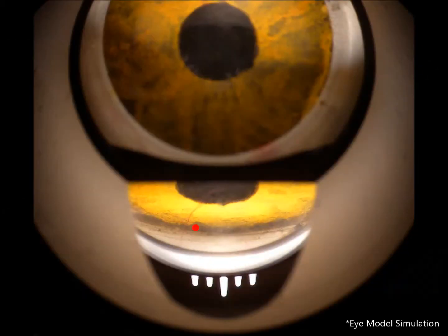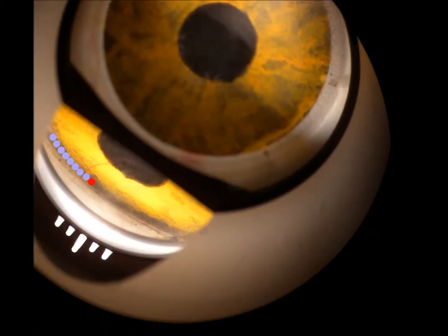This demonstration shows the 5-bar reference figure being used as a guide for placement of sub-threshold laser spots. Precise angular rotation of the contact lens ensures consecutive alignment of each series of 10 laser spots.